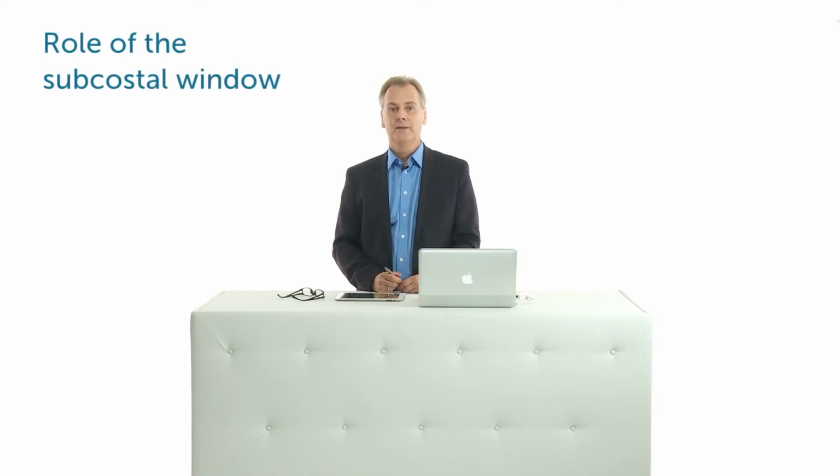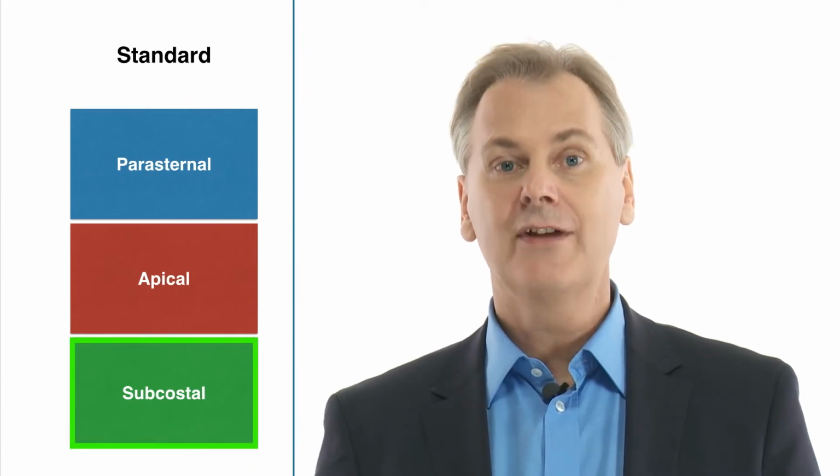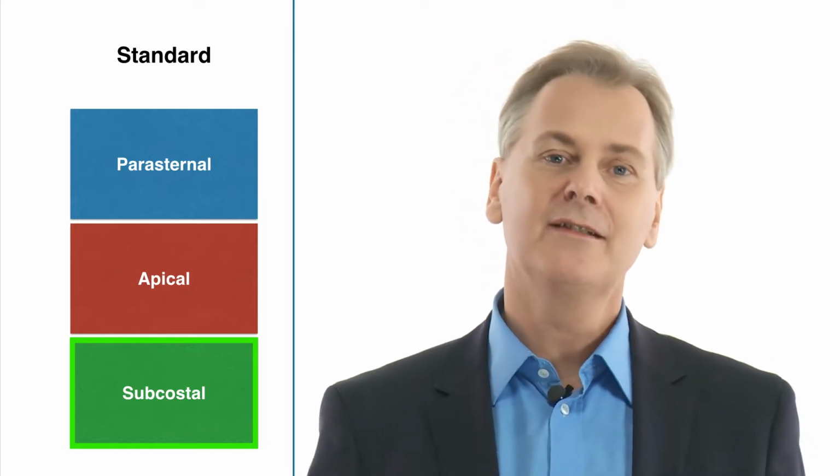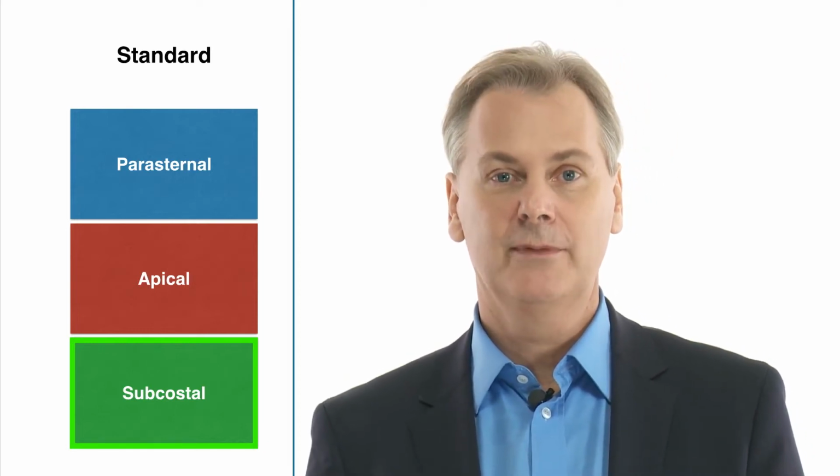The last window we'll talk about is the subcostal window. Now, if you ask me what the importance of the subcostal window is in the cardiology exam, I think it probably has the least importance. I still believe it should be a constituent of every exam, but many cardiologists don't even do the subcostal window, which I think is a pity because it does give you very important information.